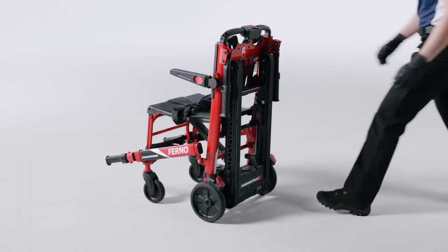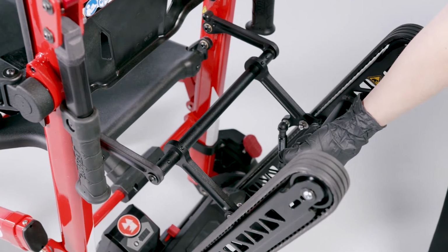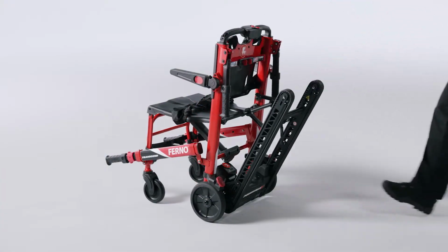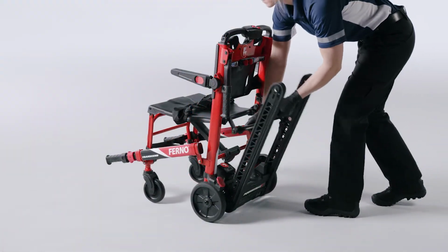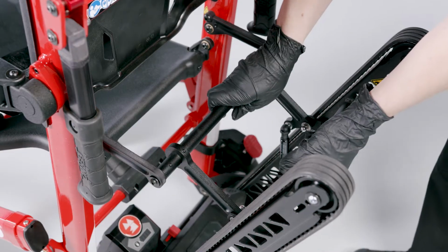To open the tracks, grasp the track cross tube and firmly pull the track away from the chair until it locks into the open position. Verify it is locked. To close, push the track hinge bar down to fold the track system.